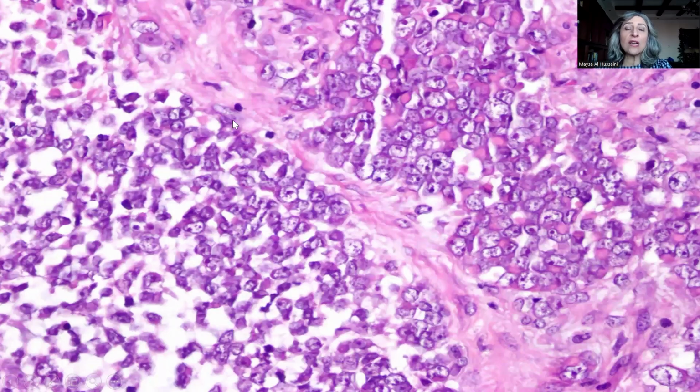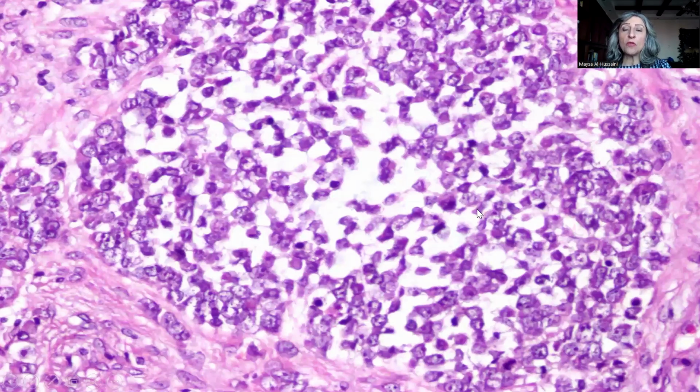And this is just to contrast, this is the small cell component, the usual small cell component of the tumor, where you have some vesicular nuclei, inconspicuous nucleoli without really abundance of cytoplasm. But as you can see, the background is somewhat myxoidish versus the typical rhabdoid morphology, where you have the cell with the vesicular nucleus, the prominent nucleolus, and then the acidophilic globule in the cytoplasm. And sometimes it impinges on the nucleus, indenting the nucleus, as in this beautiful example.